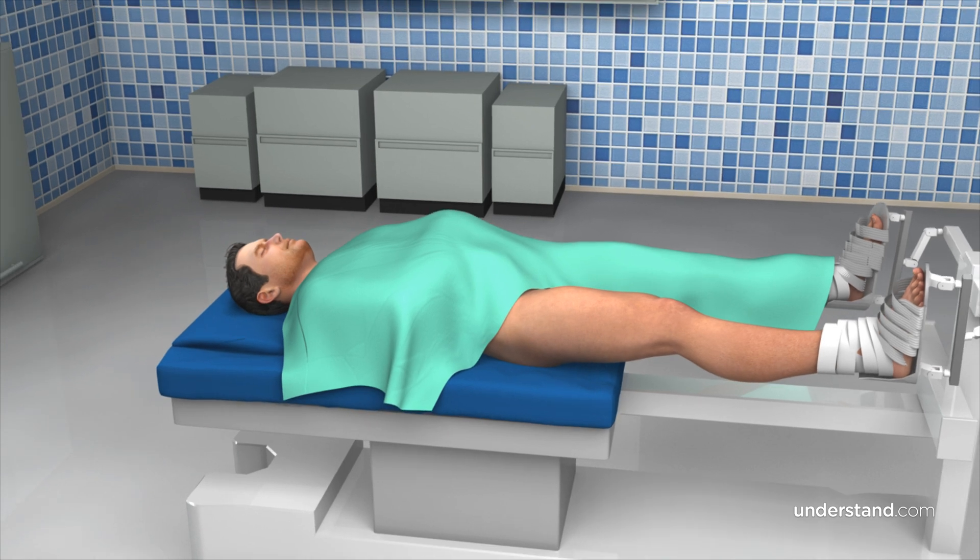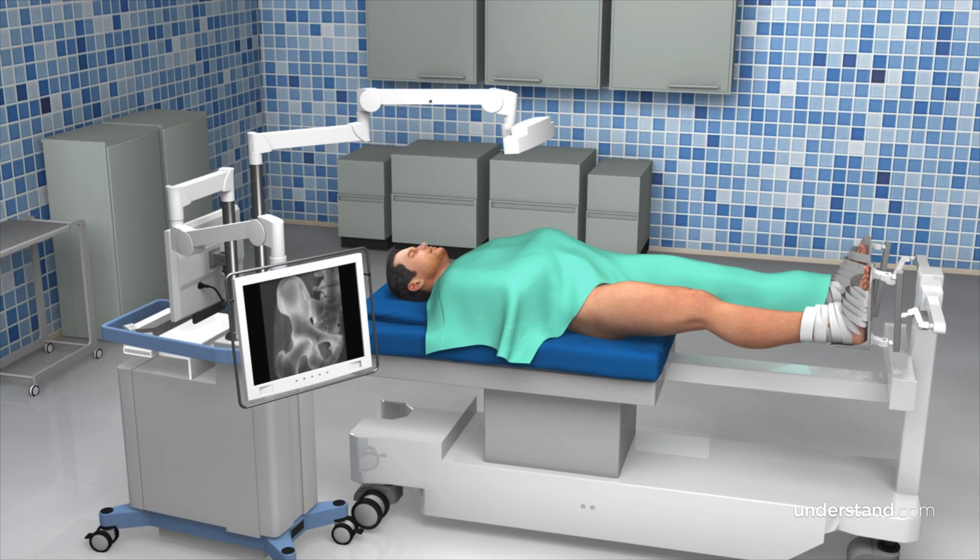Within the last few years, navigation for total hip or total knee arthroplasty has become increasingly popular among surgeons to optimize outcomes, reduce outliers, and make the surgery more accurate and more precise. The most important thing for a patient to remember is that navigation platforms — whether it's robotics, computer navigation, augmented reality, or AI-driven — they don't do the surgery for you. The surgeon still has to perform the surgery. Navigation is a tool that allows you to be more accurate when putting those implants in.